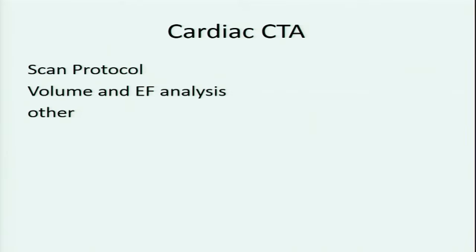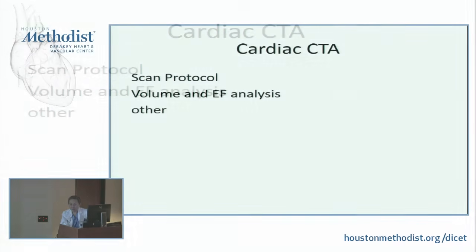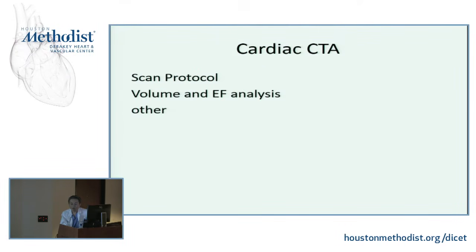Are you able to obtain LV function? Or the other way around. Let's say someone orders a CT scan for a certain indication. Do you want to use a certain protocol so you can also get the LV function, LVEF, which we know adds tremendous diagnostic and prognostic value, okay? So I'm going to spend a little bit more time on scan protocol.